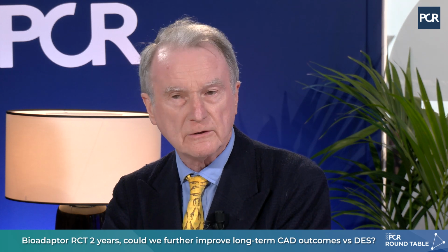But now going into practice, because this is a Bioadaptor that we already have on our shelves in some centers, I would like to ask Antonio Colombo to tell us who are the ideal candidates to start with and to gain some experience. Well, we in Humanitas have been conducting a prospective study for the past 2 years, utilizing this device, the Bioadaptor, in complex lesions. Complex lesions, I mean total occlusion, long LAD lesion.